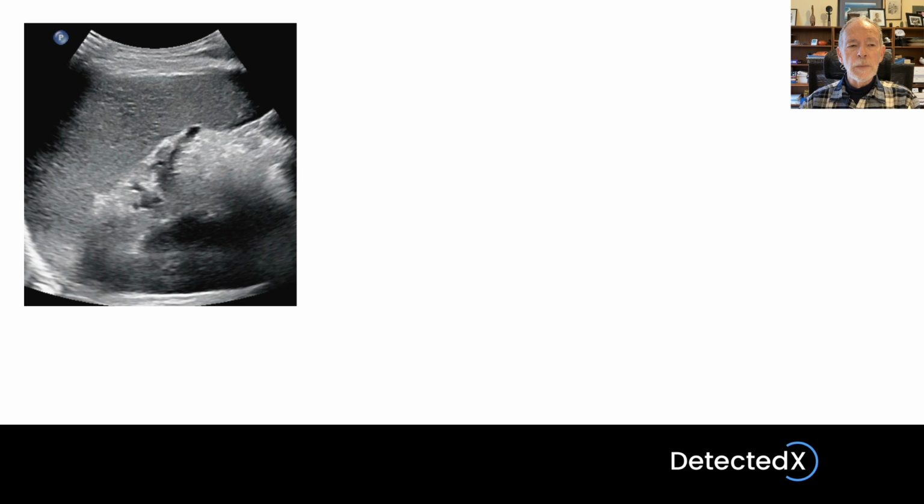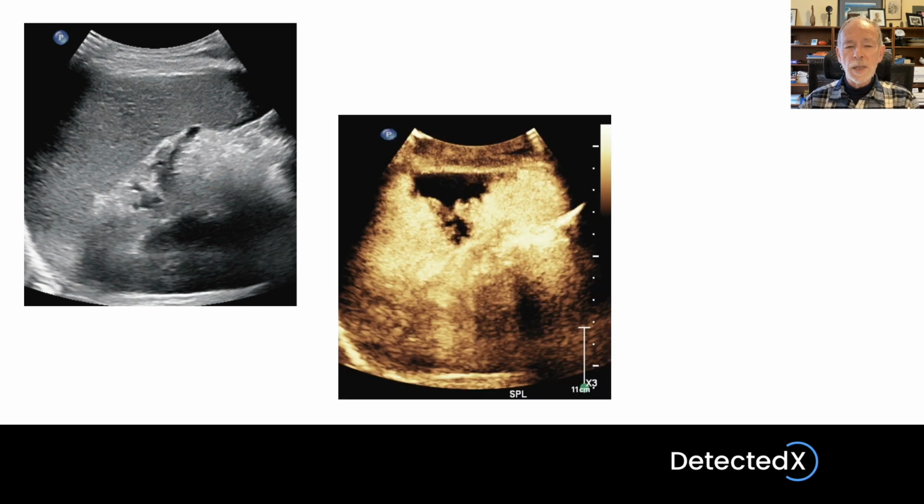Here on the left, I have an image of a liver which has contrast agent in it, but we can't particularly see that. We can't readily appreciate where the contrast agent is. Here on the center of the slide, I have a harmonic image. It happens to have been color-coded rather than being just a grayscale image, but that's neither here nor there. And what we can see is that there are some voids, some areas where the contrast bubbles have not been taken up by the liver. So that's either non-functional liver tissue or some other kind of tissues entirely. This has become a very useful method of looking at liver function.